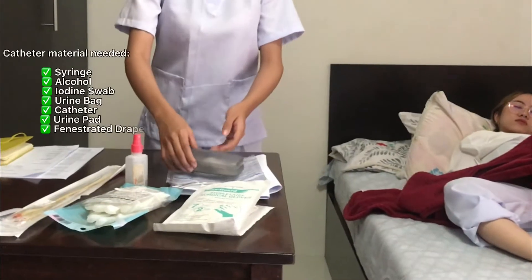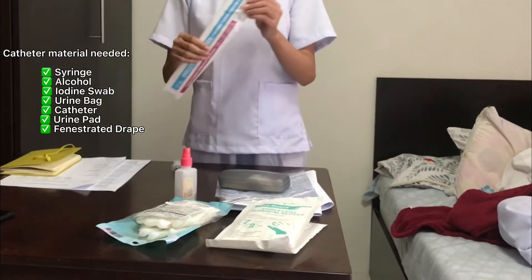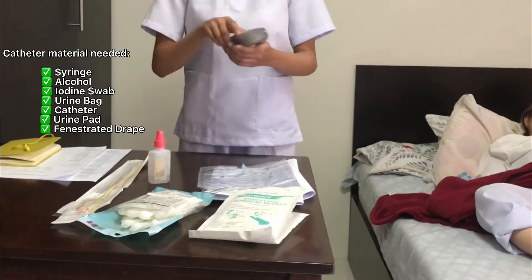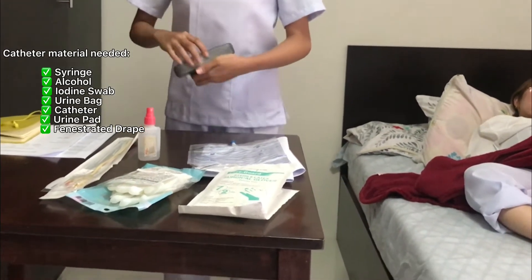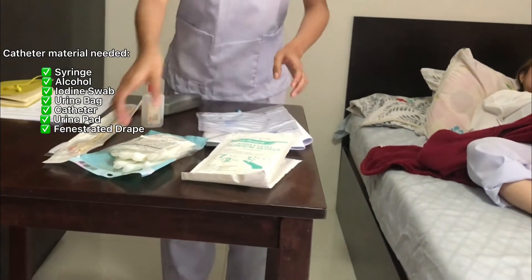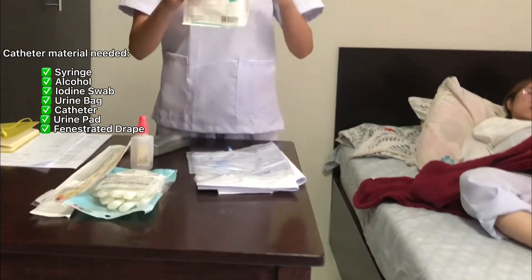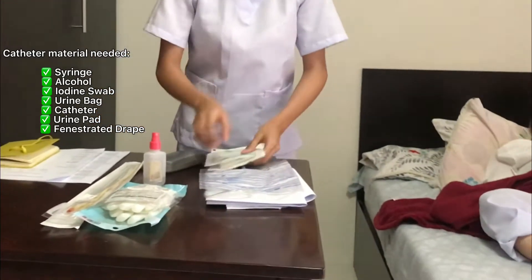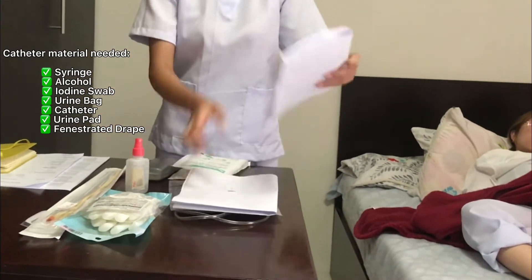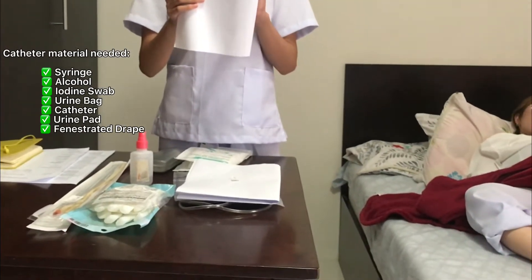First, we have the syringe, the catheter, alcohol, iodine swab, urine bag, medical gloves, sterilized gloves, and also the urine pad and the fenestrated drape.